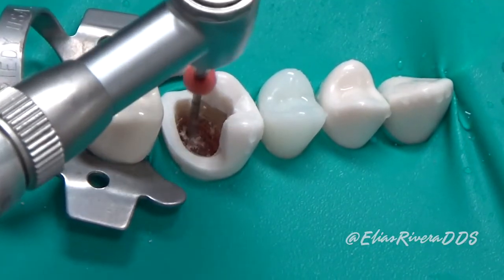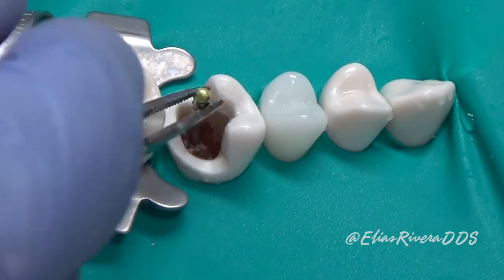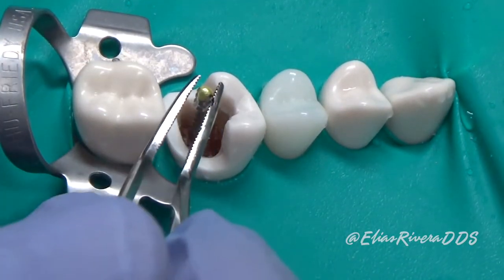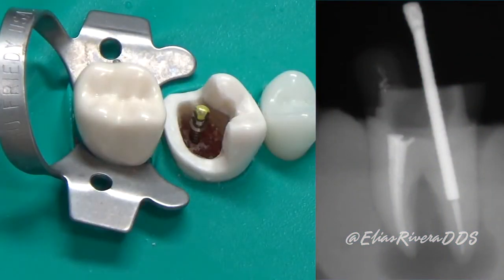Once you finish with the different steps on the ParaPro system, it's time to place the ParaPro pin. We're going to slide it in carefully, and at this point we're going to need a radiograph to verify our working length.